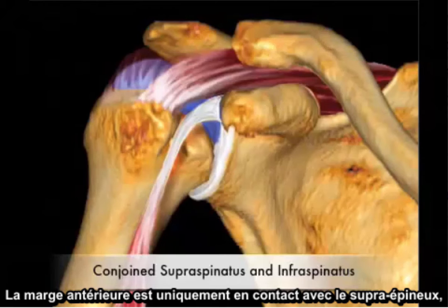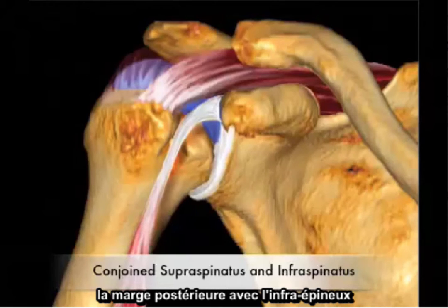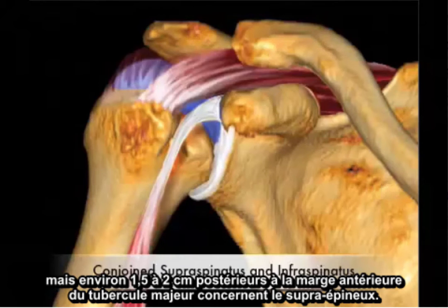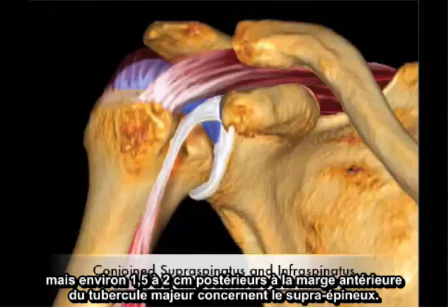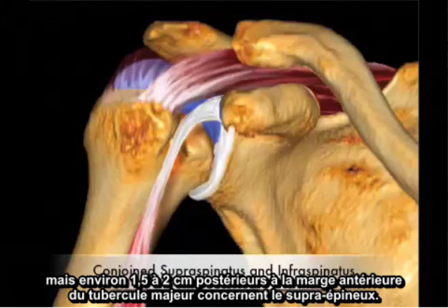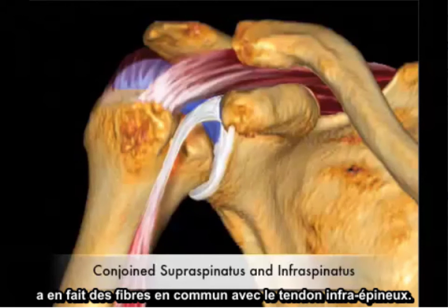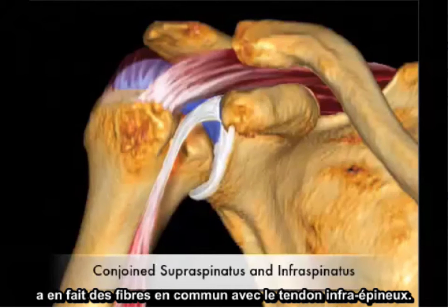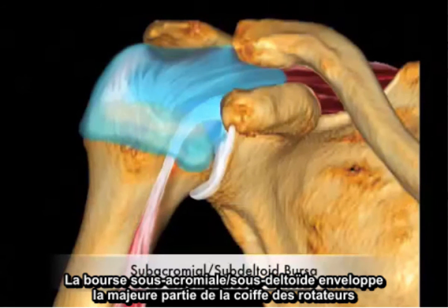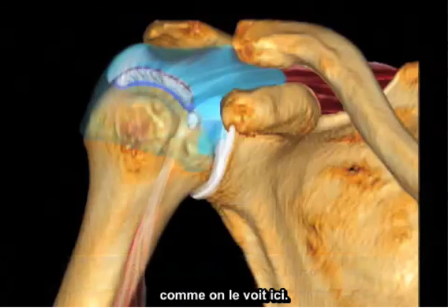The anterior margin is strictly supraspinatus; the posterior margin is strictly infraspinatus, but approximately 1.5 to 2 centimeters posterior from the anterior margin of the greater tuberosity is purely supraspinatus. Approximately 1 centimeter of the remainder of the supraspinatus tendon is actually conjoined fibers of the infraspinatus tendon as well. Enveloping the bulk of the rotator cuff is the subacromial/subdeltoid bursa.